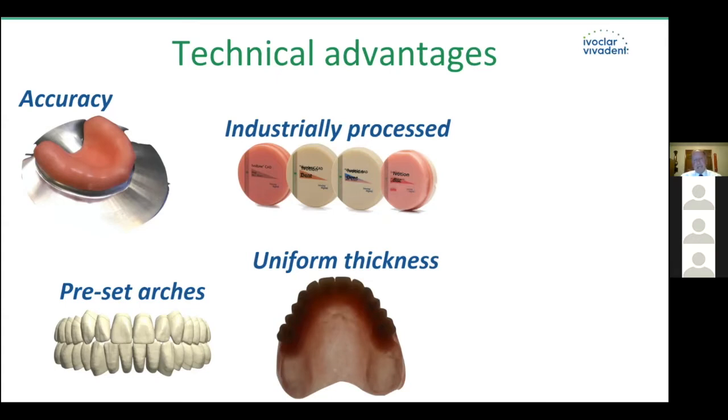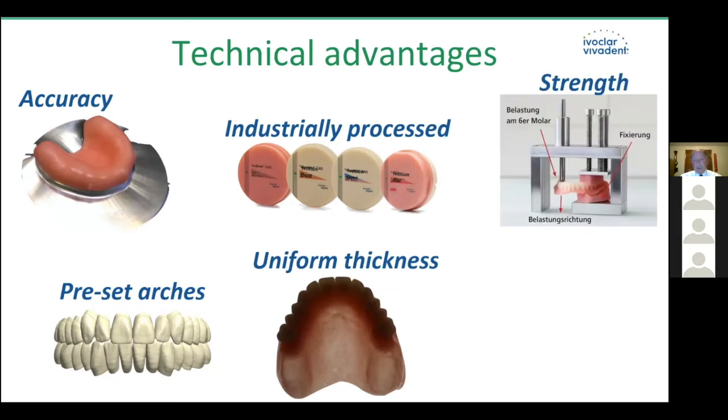I think the uniformity is one thing, but also it follows the tissue surface, the intaglio of the patient, so that it really does follow the actual contours of the patient's mouth, as opposed to us just arbitrarily filling in the palate with wax and literally not following the contours of the palate. So an interesting side benefit and very effective as far as patient comfort. Strength, it's off the wall.